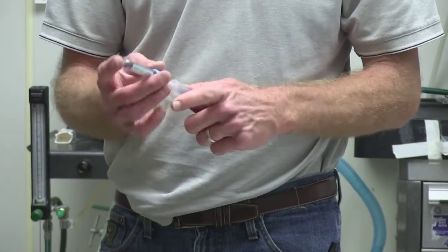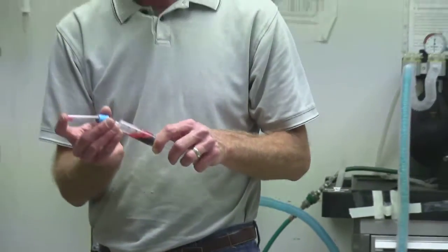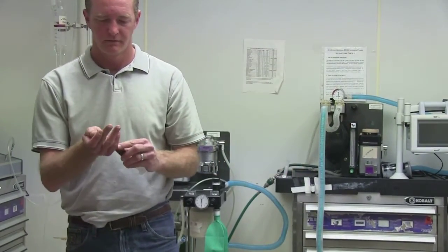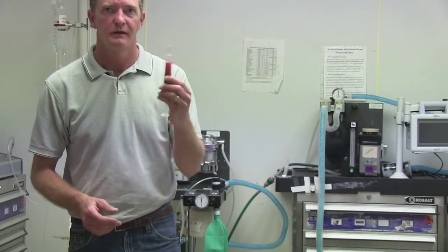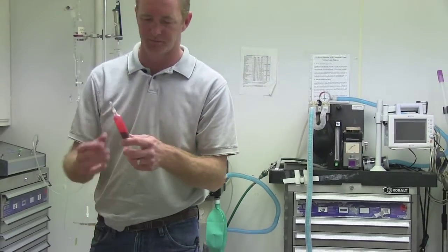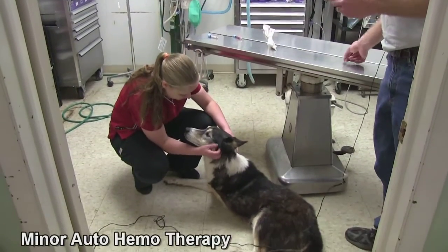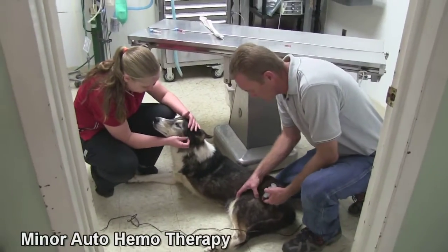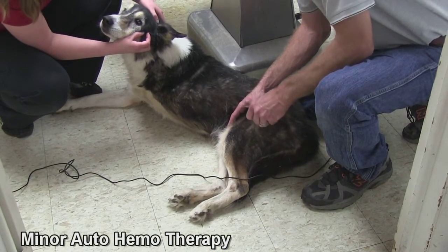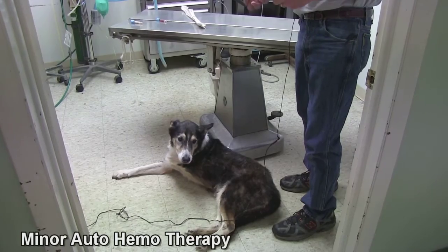Minor auto-hemotherapy is similar to major auto-hemotherapy except it uses a smaller amount of blood — 1 to 2 cc's. You take the blood infused with ozone and mix it in the same way. You get your blood-and-ozone mixture in a syringe, hook it to a needle, and inject that intramuscularly — wherever you want to stimulate an immune response or promote ozone absorption into the tissue.